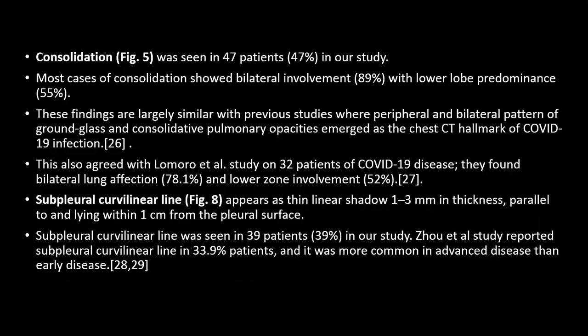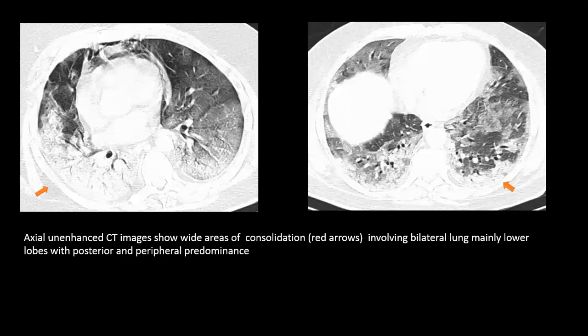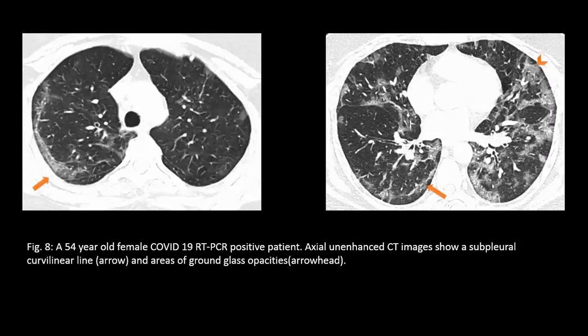Another finding is consolidation, which is mostly bilateral with lower lobe predominance, consistent with previous studies showing bilateral ground glass and consolidation patterns. Subpleural curvilinear lines appear as linear shadows 1–3 mm in thickness, parallel to and lying within 1 cm of the pleural surface. An axial enhanced CT shows consolidation by the red arrow involving bilateral mainly lower lobe and posterior peripheral areas, and another enhanced CT shows subpleural curvilinear lines and ground glass opacity as indicated by the arrowheads.